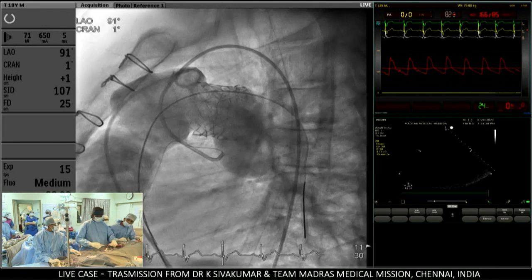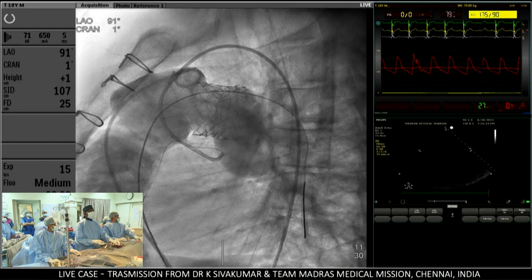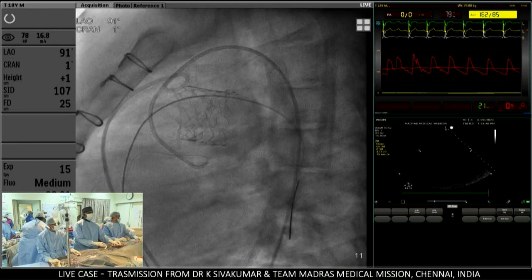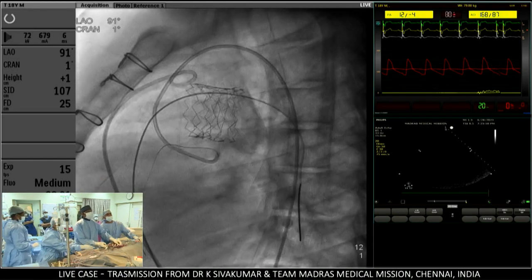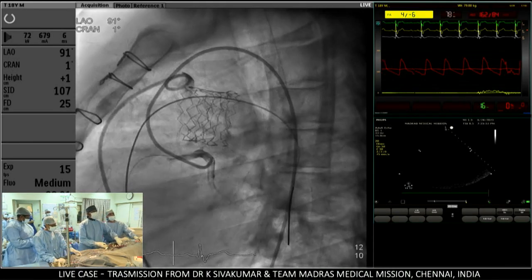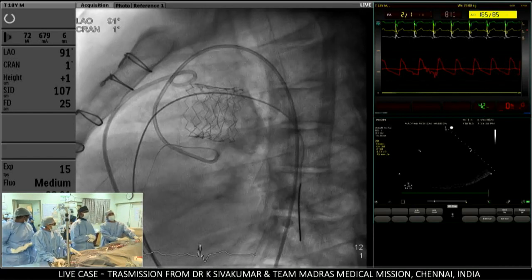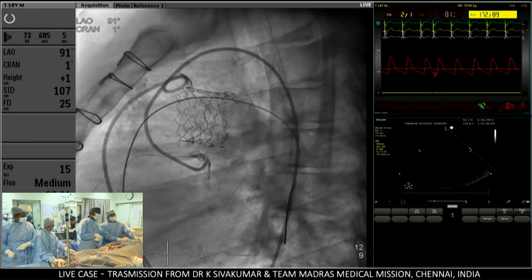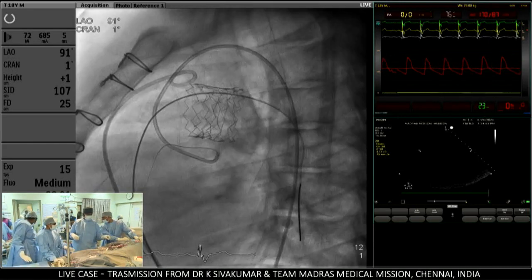Any questions? Again, this is a fascinating case that she was doing, very challenging stuff. Shiva, are you worried about the proximal RVOT stenosis? I think the dynamic obstructions, in the right ventricular conduit junction. Yes, I think the proximal part, proximal RVOT.